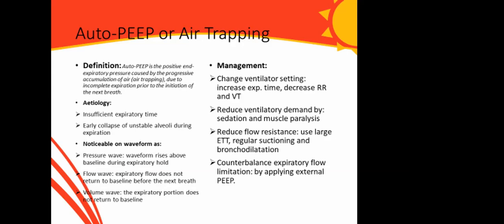Now, you can notice auto-PEEP on your waveform. If you have a pressure waveform, you'll see that the waveform rises above the baseline during the expiratory hold. It doesn't touch the baseline.